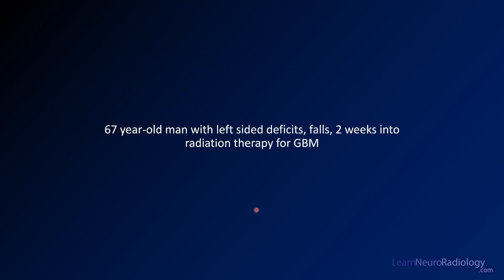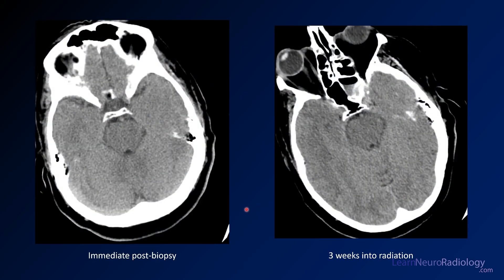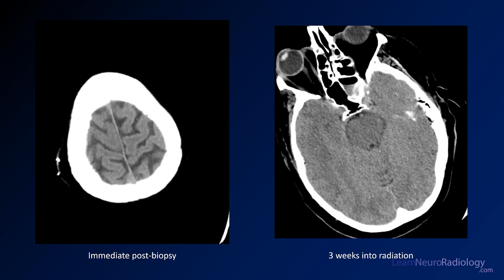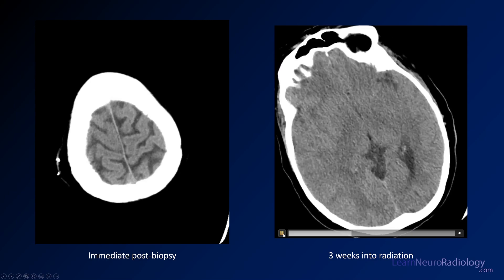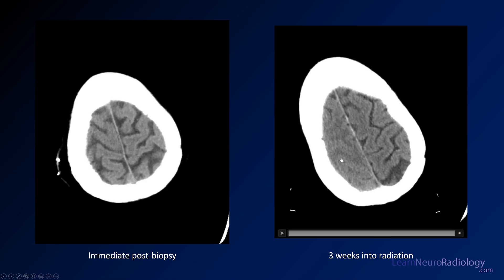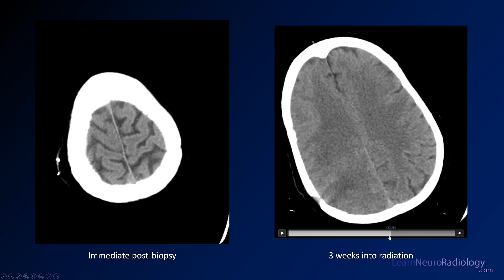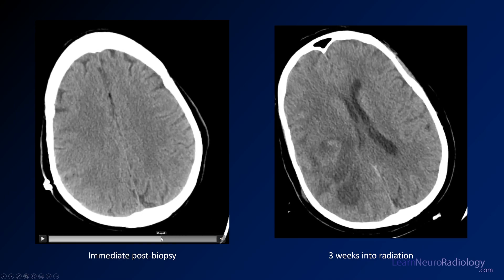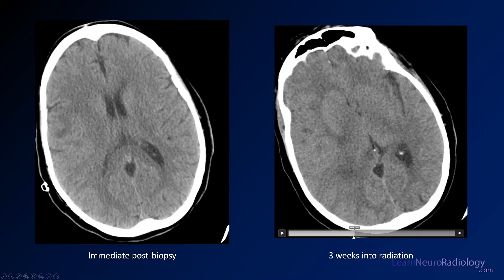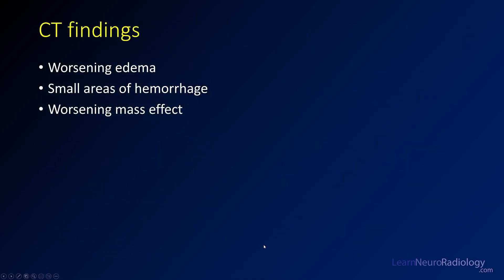Another case: a 67-year-old man with worsening left-sided deficit and falls two weeks into his radiation therapy for glioblastoma. Here's his immediate post-biopsy imaging — it looks not too bad, not a whole lot going on. When he gets three weeks into his radiation, however, it's a lot worse. You see much more swelling of this side, a lot more edema in that hemisphere, some areas of hemorrhage, increasing edema, and worsening mass effect on the lateral ventricle — it's displaced to the other side. On CT, you want to describe that worsening edema, worsening mass effect with small areas of hemorrhage, which are likely contributing to his symptoms.